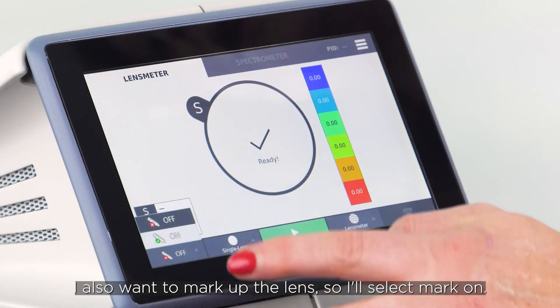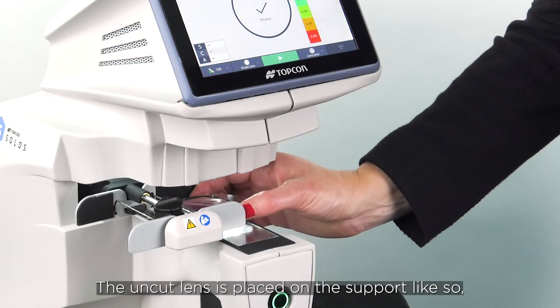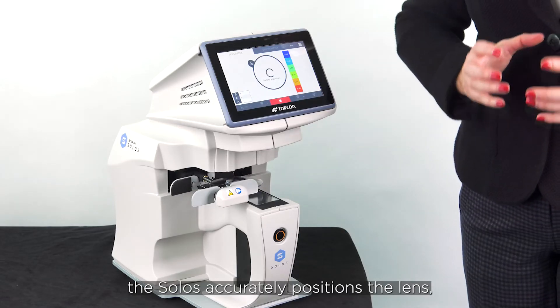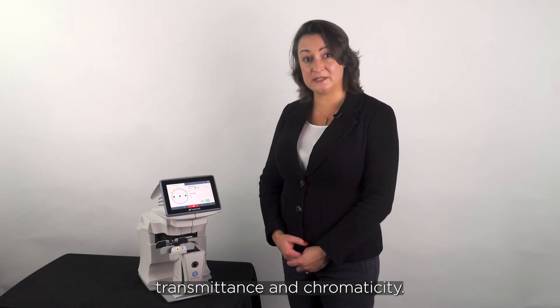I also want to mark up the lens so I'll select mark on. The uncut lens is placed on the support like so, and when I press the capture button the Solos accurately positions the lens and maps all aspects of the lens power, and if I'd selected it, it would also measure the transmittance and chromaticity.